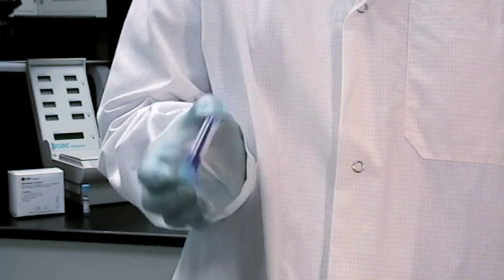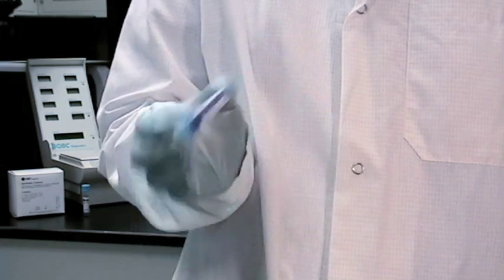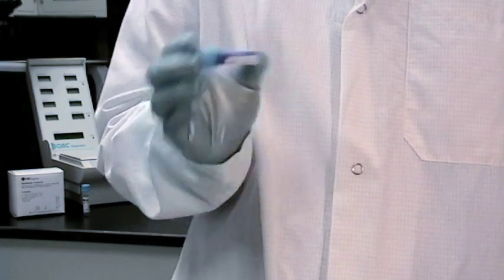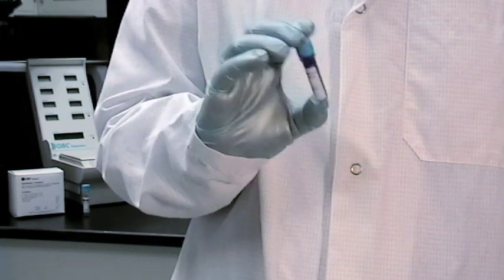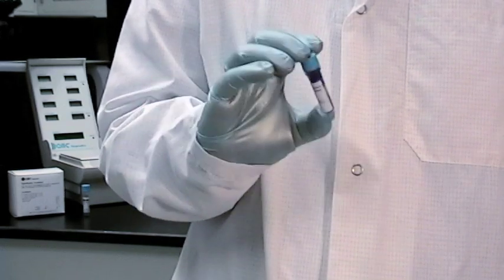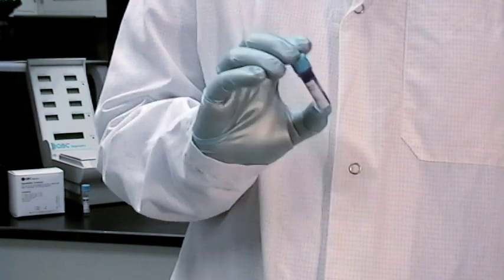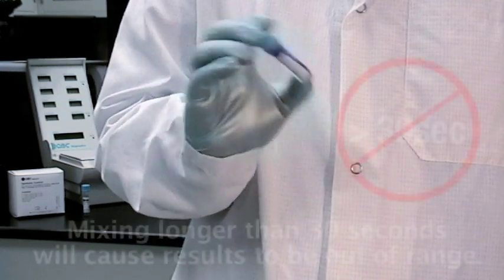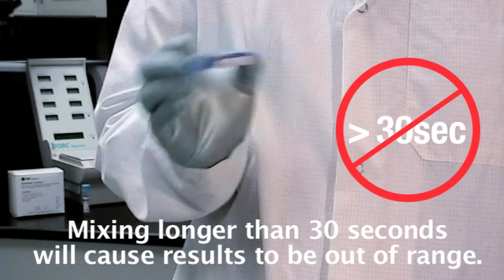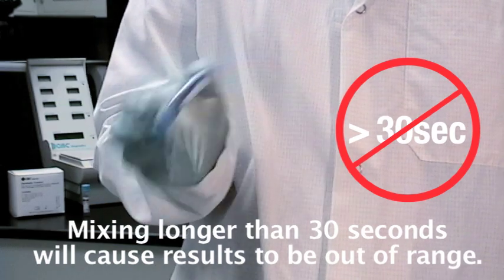During this step, the vial must be completely inverted, allowing the control to run down the sides of the vial repeatedly. It is important to make sure that this step is done briskly, since slower inversion will not provide adequate mixing and will yield poor results. Also note that mixing longer than 30 seconds will cause results to be out of range.